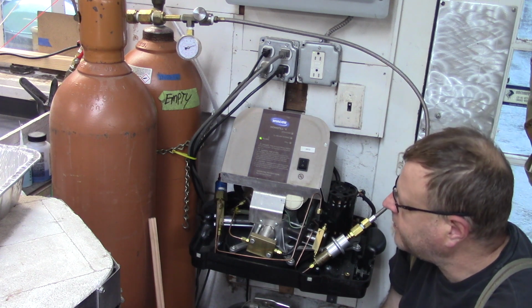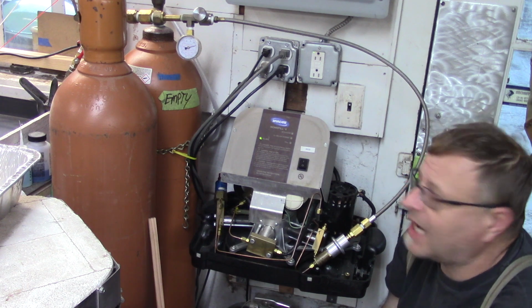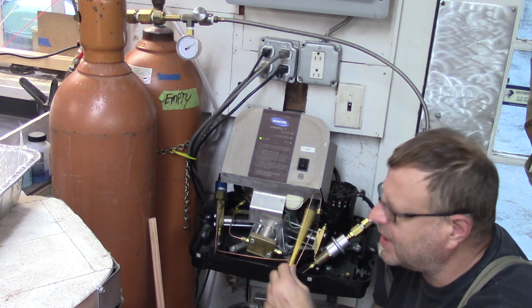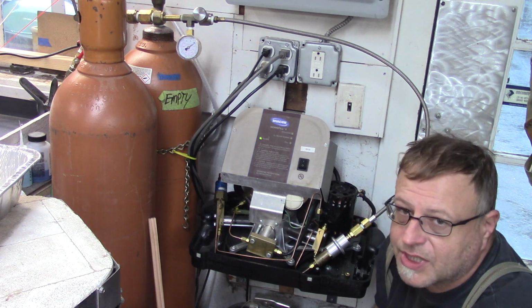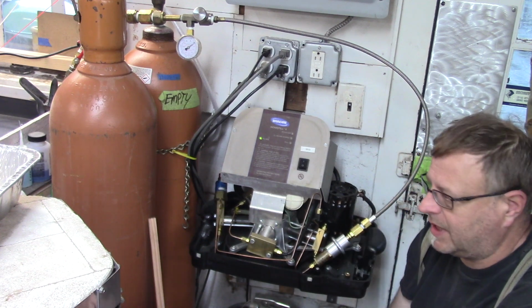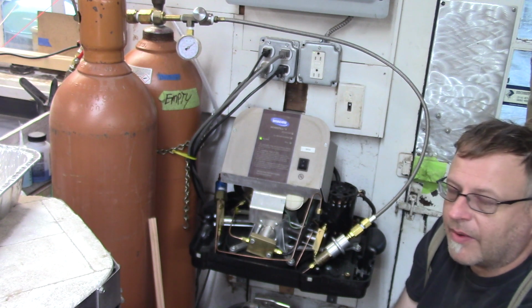Now, what does that mean? The short answer is I don't know, other than you're creating a problem. This is creating a problem, and I don't recommend doing it. But if you're in the same position I am, which is I don't have $160 right now to purchase the piston seals, then this is kind of what you're stuck with.